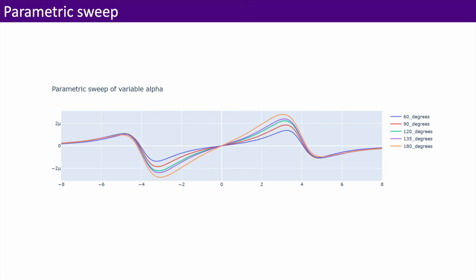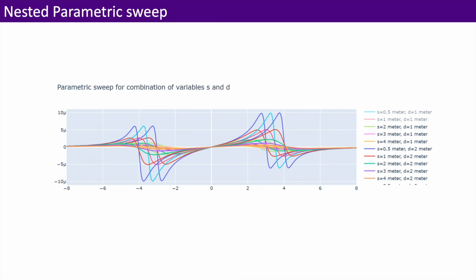Then after we are done with visualizations and make sure that everything works as expected, we will do parametric sweeps. So we'll study what changing alpha does to our fields. Then we can also do nested parametric sweeps, so we can study combinations of multiple variables. In this case, we see parametric sweeps of different combinations of separation and distance. And finally, we will be able to do nested parametric sweeps, which will take two or multiple variables and study the combination of them. So now, after we understood the whole procedure, let's go to Jupyter Notebook and see the Python implementation of our gradient coil simulation.